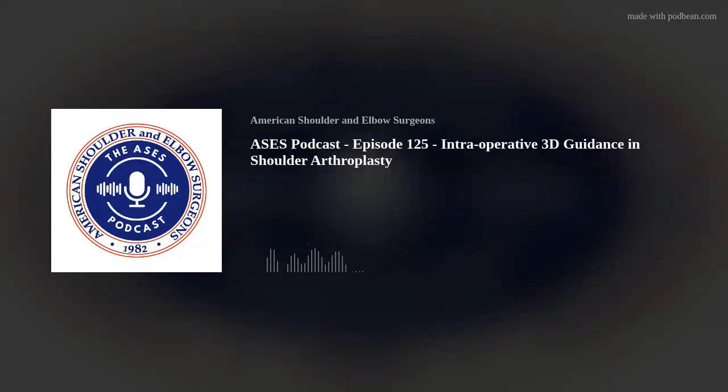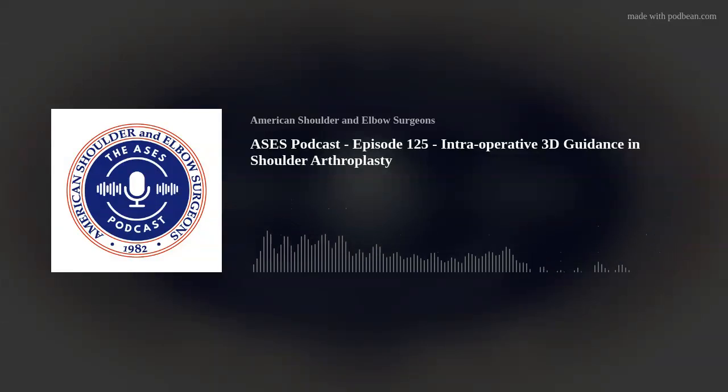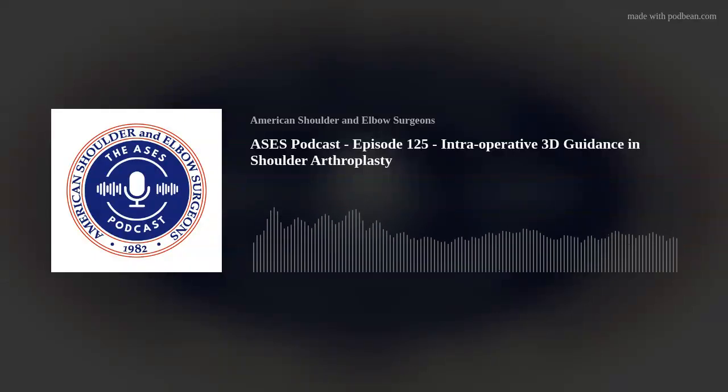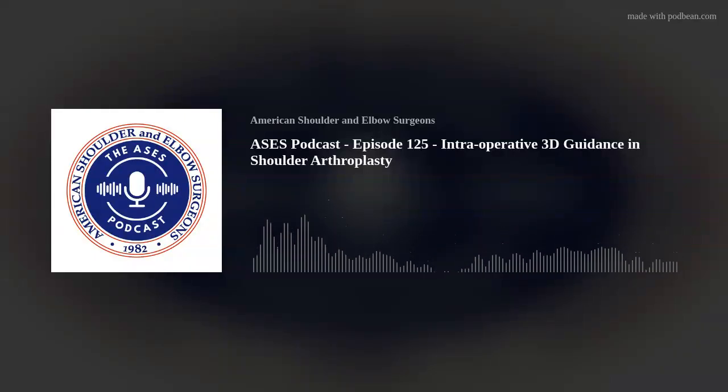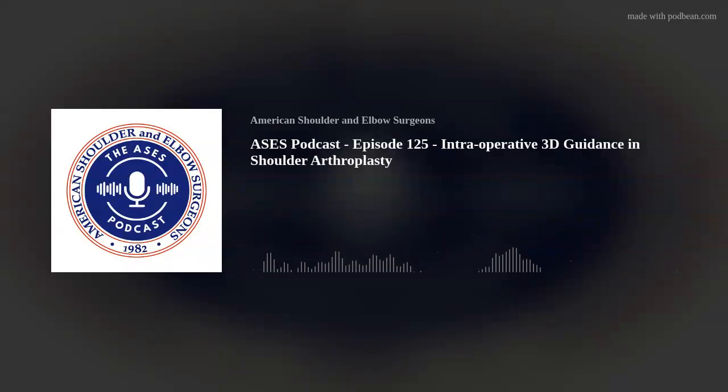As you mentioned, with patients who have an MRI or existing imaging that's not a CT scan compatible with the planning software, I still will try to get the CT scan. Most people are understanding of this, and when you discuss it with them, the ability of looking at it in 3 dimensions and actually having the ability to place the implants for better understanding in the virtual world of what you're going to encounter, most of them are more than willing to go through the CT scan to obtain the benefit of that.